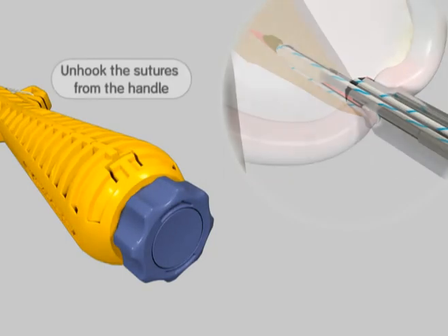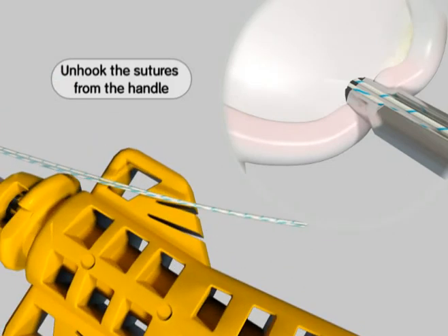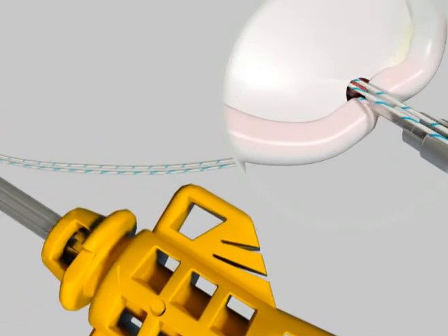To finish, unhook the sutures from the handle and disengage the handle from the anchor by pulling straight back or tapping the distal end with a mallet. Discard the insertion device.